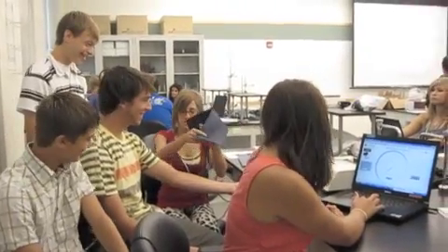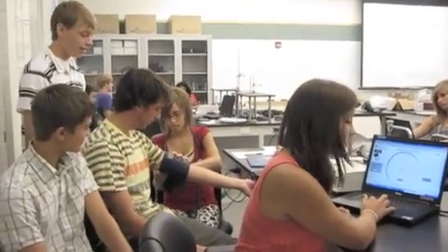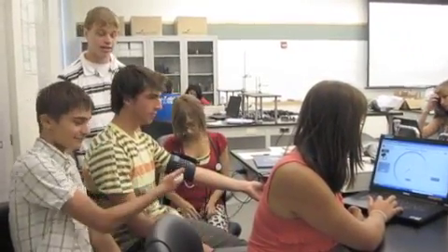So the lab that we are doing is a blood pressure lab. First we are going to calculate the manual blood pressure of Mike right here. So first she's going to attach the blood pressure cuff, aligning the artery patch on the cuff with the artery on it.